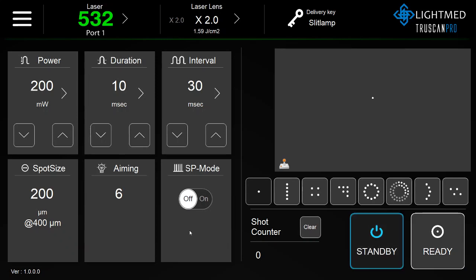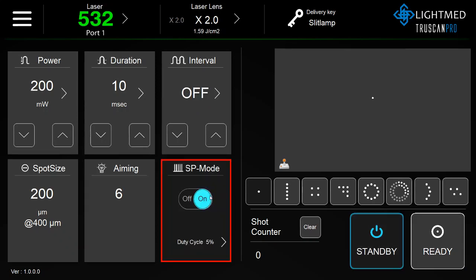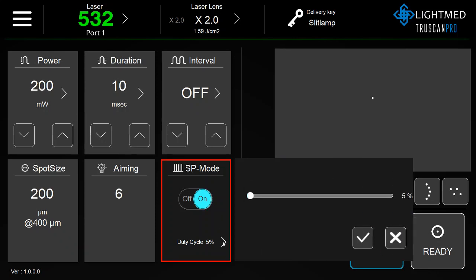In order to turn on SP mode, drag the off button to the right, and select the right arrow to adjust the duty cycle. Click the check mark when ready.